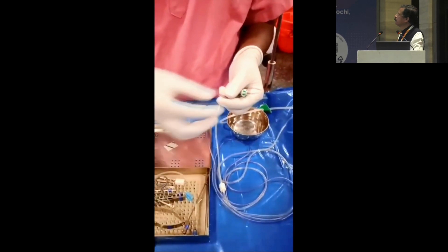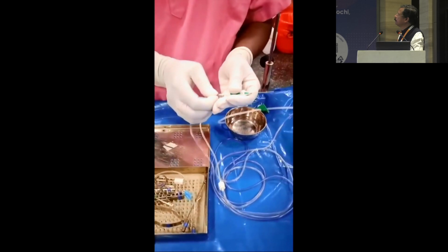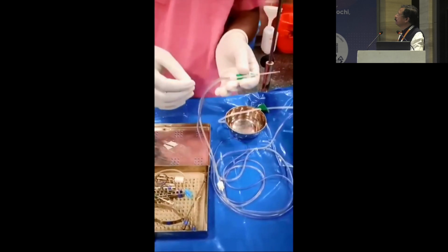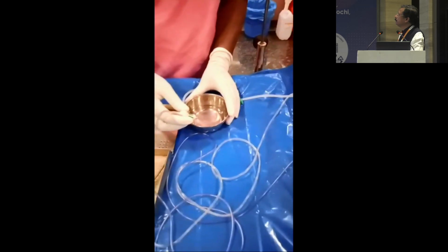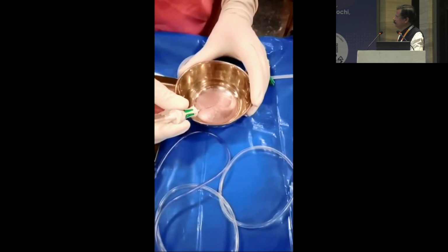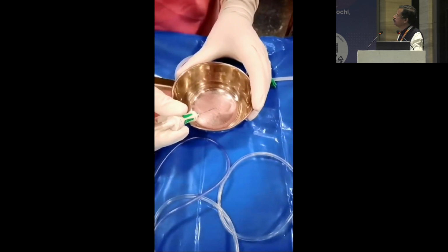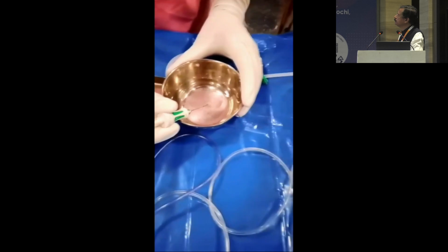Now, how to maintain the anterior vitrectomy machine after the usage? Every time after completion of the anterior vitrectomy, you reconnect the machine, take a bowl and put BSS in there and put the probe inside and check cutting as well as aspiration.